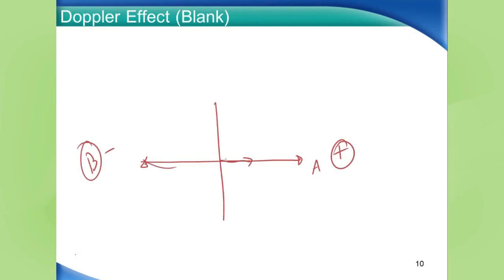In fact, we could say if the train is moving towards observer A, that was at 0 degrees, and he saw a positive 100% of the shift, and observer B was away from him, at 180 degrees, and so we'll say it was minus 100% of the shift. Okay? And hopefully that should look familiar to you because it should look like the beginnings of what we just learned about the cosine. So we don't have time to derive the entire Doppler equation today, but we can basically come up with an idea of what the equation is, and we'll write out the equation.